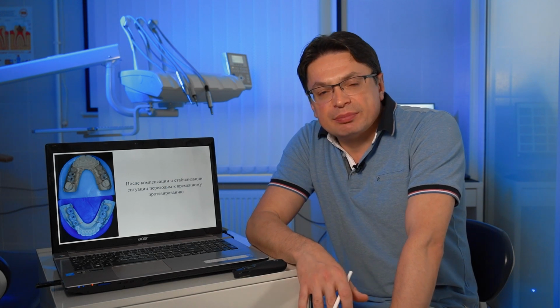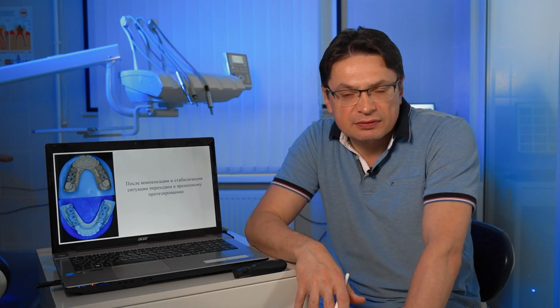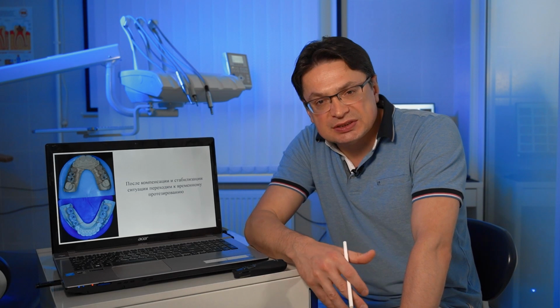Planning stage. These two stages are probably the most difficult as they provide the pinnacle of understanding the occlusion itself, the joint and work planning. And of course, a 10-minute video isn't enough to tell and understand all this in more detail. But I hope that I define the path to reflection for you. And then it's up to you, because the knowledge and experience you would like to gain you can only gain yourself. I can't do it for you, I can only help. Show examples and tell, reasonably explaining why we acted this way and on what grounds and with what calculations.